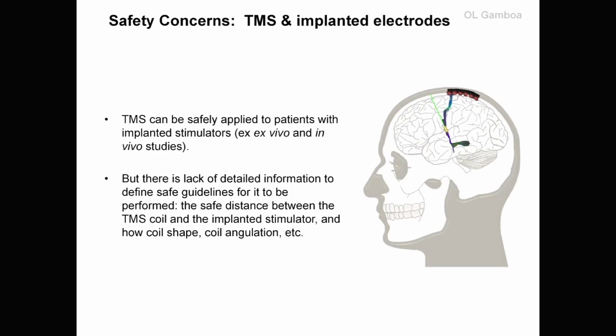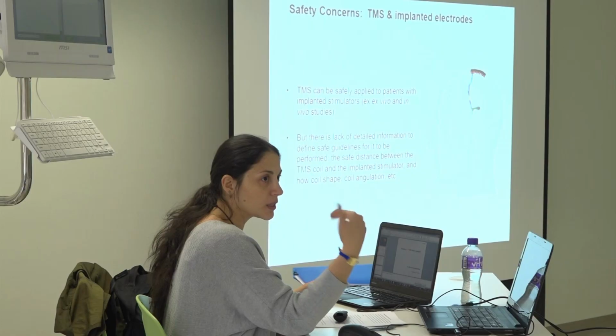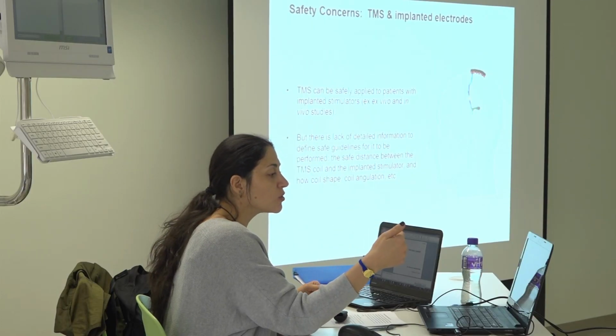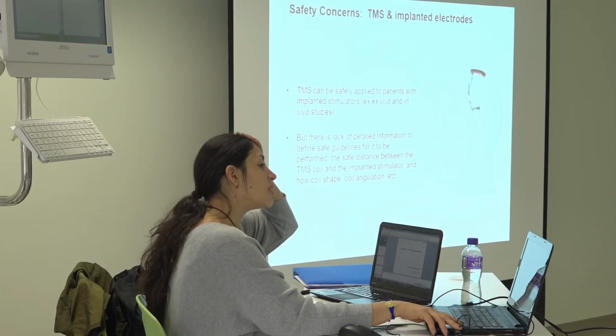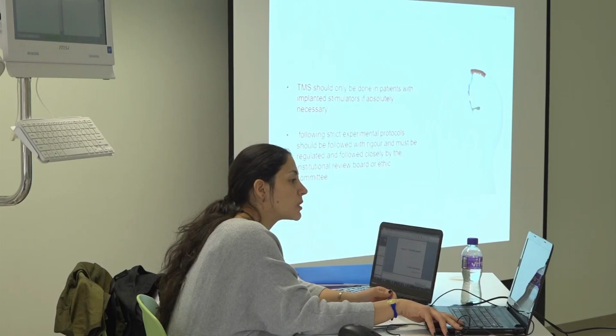Something about implanted electrodes. TMS has been done with patients that have implanted electrodes, but obviously you should test it before. There is not a lot of knowledge about it, but there are studies that have been done. So anyway, you are not going to do it, but just keep an eye on that and ask for expert opinion and testing before doing some experiments.